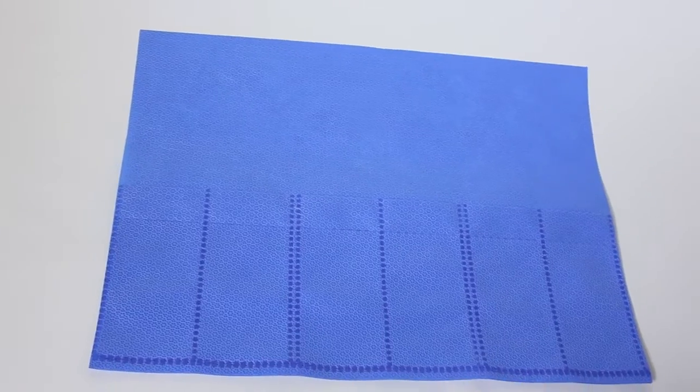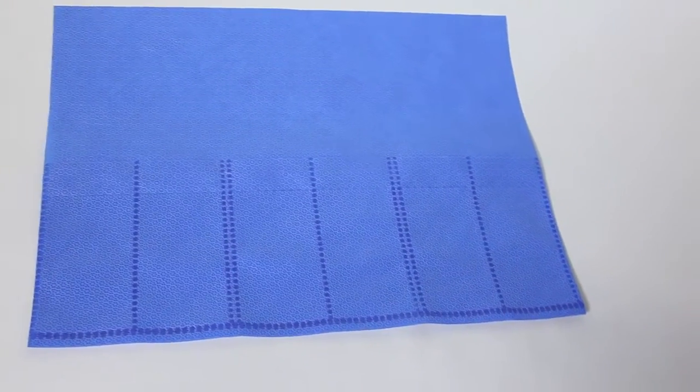Our DuraHolder protects surgical instruments from the sterilization facility all the way to the operating room and comes in over 100 styles to meet your specific application needs.